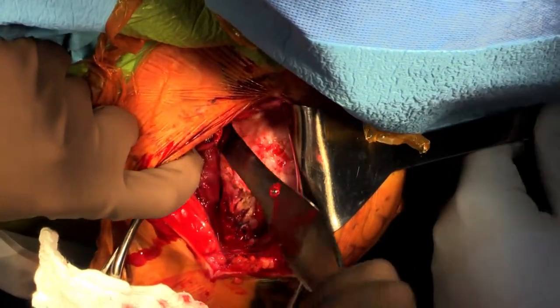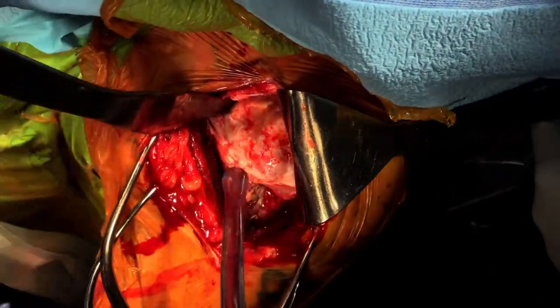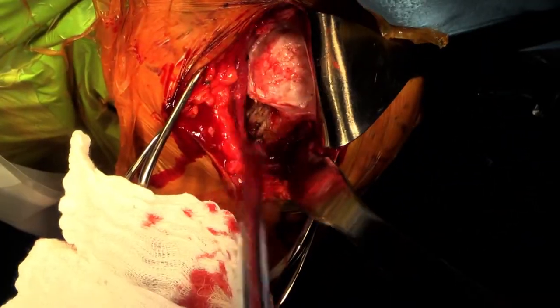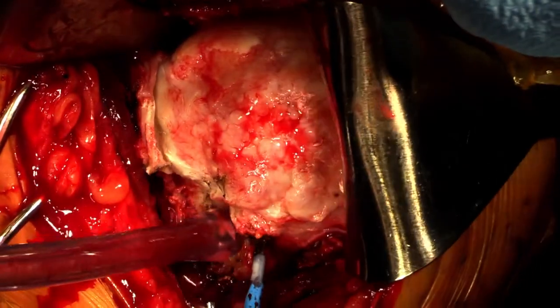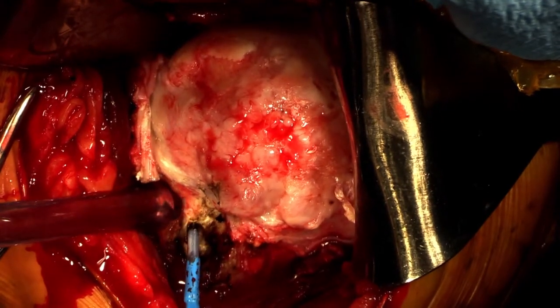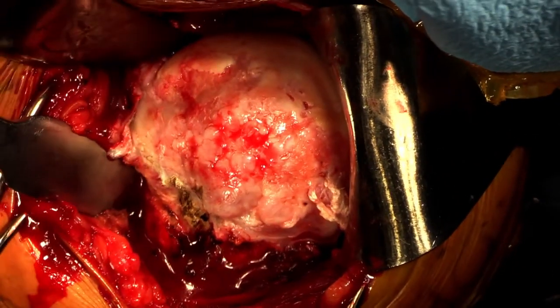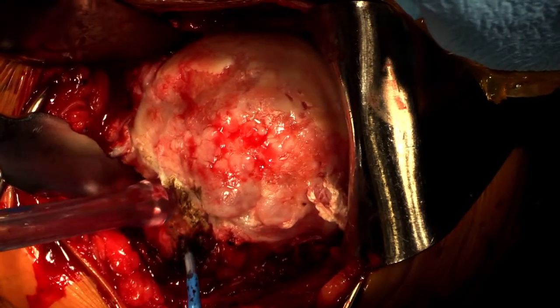Place the dull Hohmann underneath the conjoint tendon group. You can see there is no subscapularis. With this system, while performing a reverse, some surgeons choose not to repair the subscapularis. Place a Hohmann around the humerus and release the inferior capsule all the way to the 6 o'clock position of the humerus.